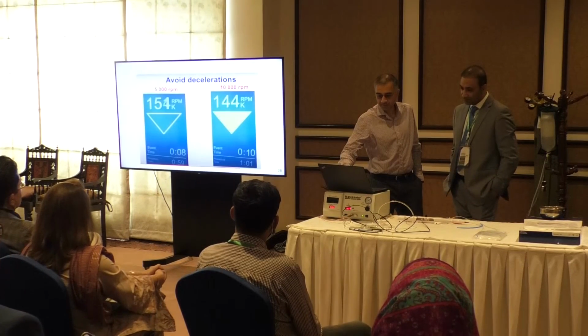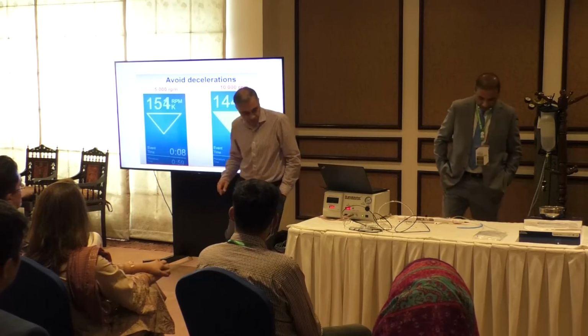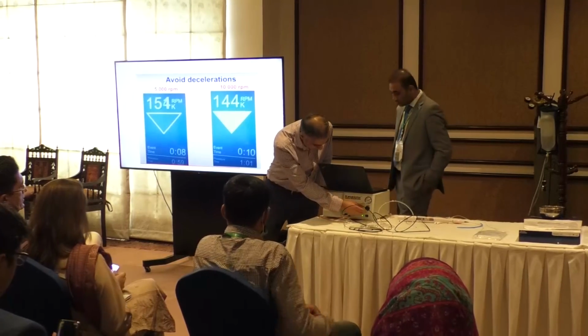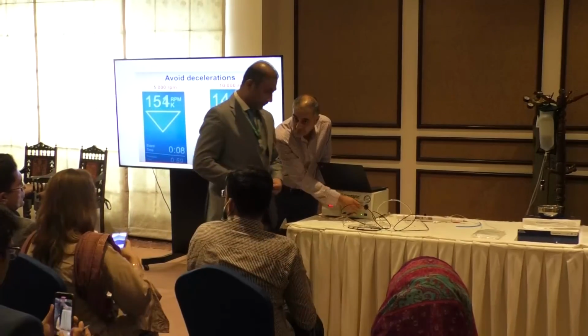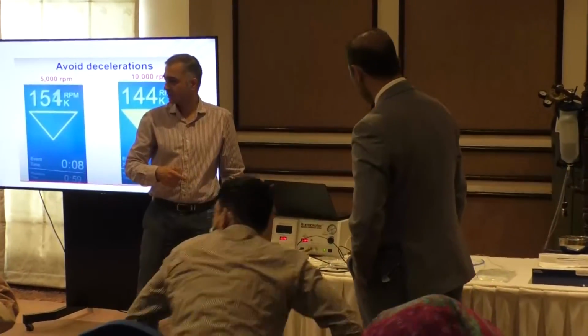So, very quickly, this is your console, and you will get your physiologist to set the speed that you want the rotor burr to go at. Okay. So the first thing, do you want to all come around now? We can start the practical session.